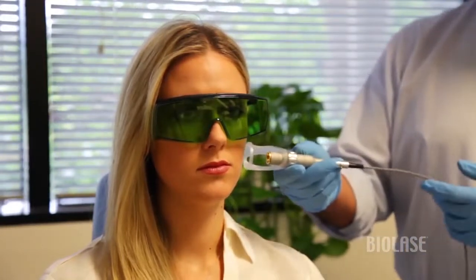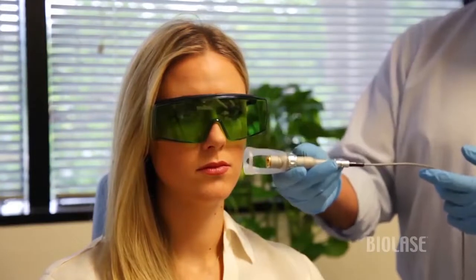Using this specific handpiece that has a spacer on it — which gives us an exact power density — we place it toward the skin, activate the laser, and keep it moving so that we don't have any undue buildup of heat.